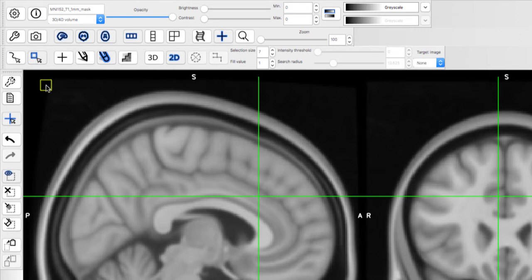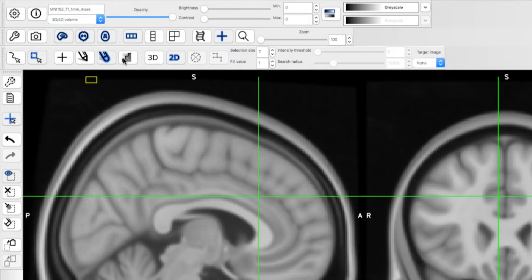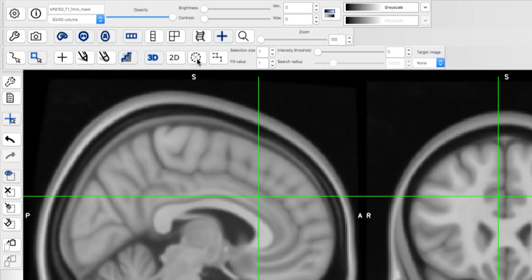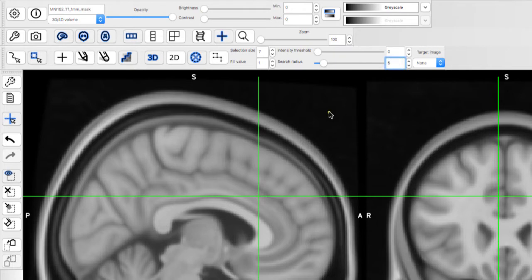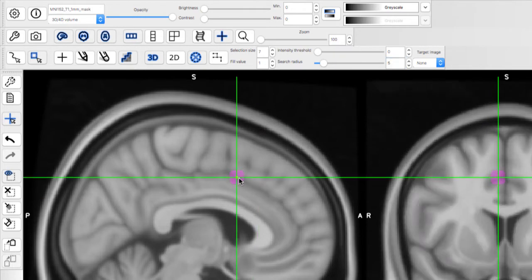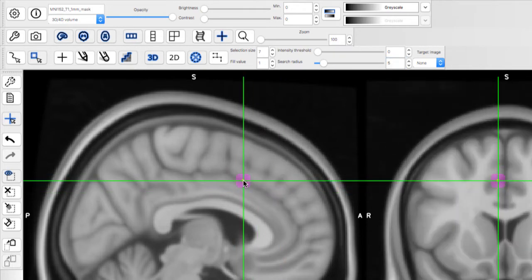Let's see how to make a spherical ROI with a 5 millimeter radius. Click on the Select by Intensity tool, the 3D button, and the Limit to Radius button. Then select a search radius of 5. Once you've placed the sphere where you want, click the Fill button.